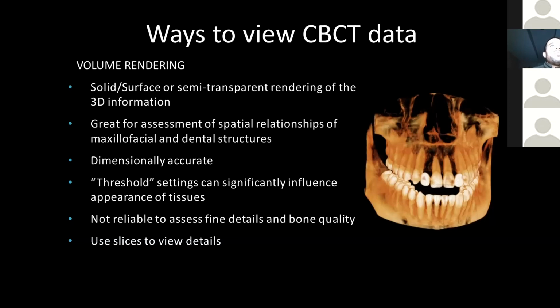Any recommendations on a cone beam CT machine or a software that you would use in general dental practice that focuses on cone beam CT being used for implants? Oh boy. I would start first, again, looking at field of view. And if you're looking specifically for implants, get probably a medium field of view unit. So something that'll do both arches. And that's anywhere from like an 8 by 8 centimeter or 10 by 10 centimeter. If you happen to do bigger implant surgeries, maybe get a larger field of view. If you happen to do more endodontics, maybe get one that also does a smaller field of view, 5 by 5 or something like that.